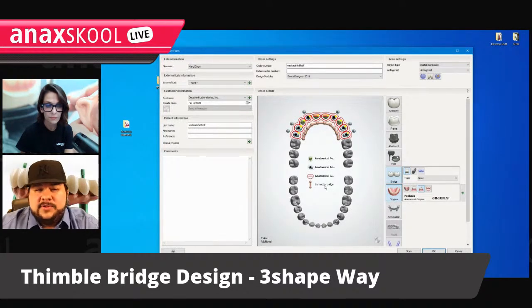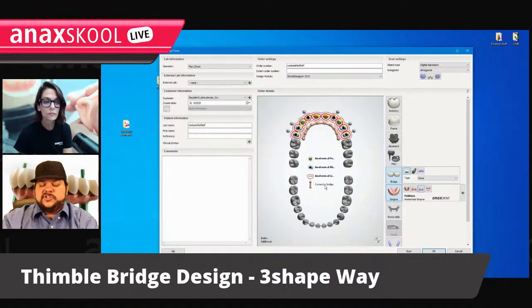That's how you set it up in 2019 because that's how it works. This is just for the bar. In 2020, if you're working with that, they're very clever. They set it up so that you do this order, but as soon as you're done, you start building the crowns on top at the same time so you can get things manufacturing at the same time.